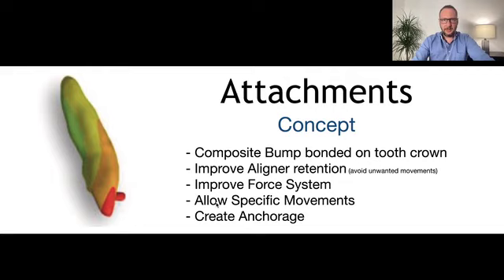For example, in a very expulsive crown, for example a cuspid, where we want to extrude the crown. Imagine us trying to do it with plastic holding only the crown. It's not going to keep the aligner well seated, and then the aligner is going to extrude, but the crown and the whole tooth are not, right?